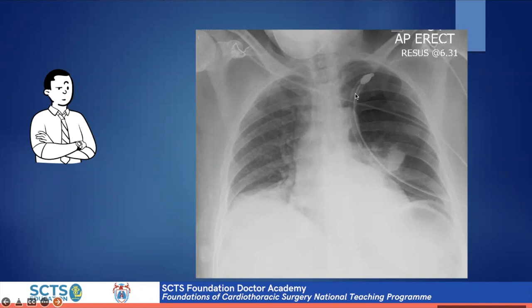That's right, yeah. I don't know how this happened, but the drain tip, which is the end of the drain, which we normally cut off and attach to the rocket bottle tubing or the drainage system, has been inserted into the chest cavity. And when I was saying about checking for the holes in the tubing to make sure they're in the chest cavity, you can see here that there are no holes in the chest drain. So they've inserted it upside down essentially and probably introduced a worsening problem for this pneumothorax on the left side of the chest. So that was a very worrying chest x-ray to receive.